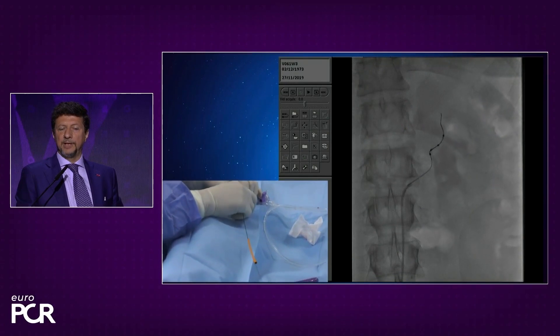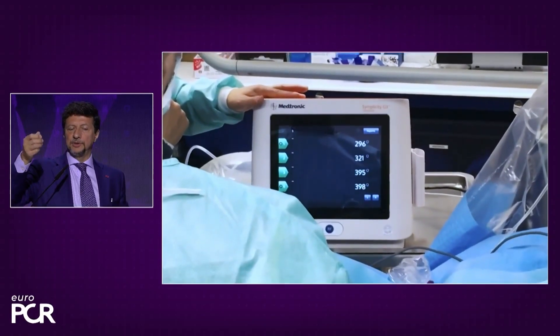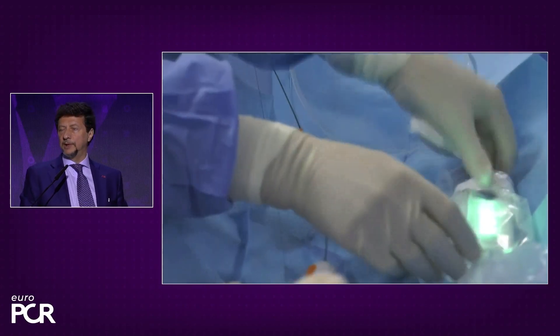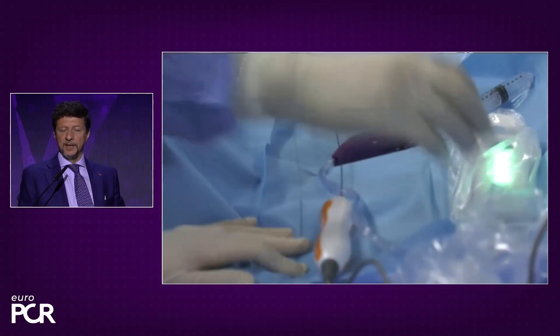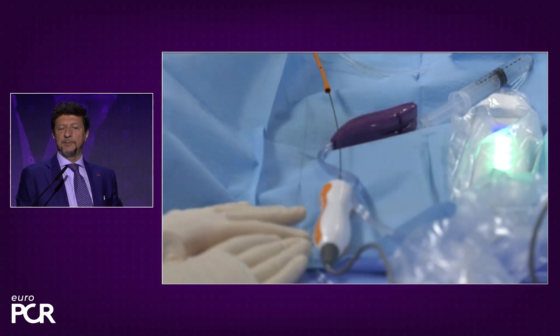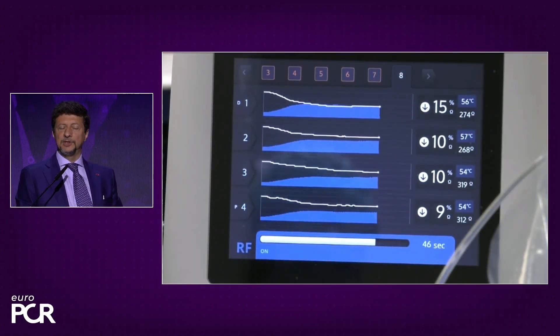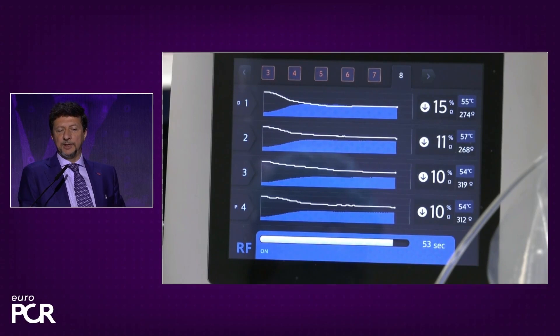This is a regular BMW wire. After we reach the position, we retrieve the wire, and this creates the curly shape of the tip that exposes the four electrodes in a circumferential way. Now we are ready to give the energy — we press the button. It makes a sound, and during one minute it will deliver energy. What you see on the right side is the temperature — between 57 and 54 degrees centigrade — and the impedance. After one minute, it will stop.